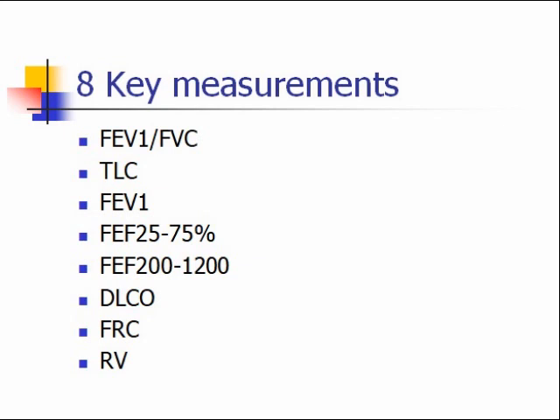Well, that does it for interpreting pulmonary function reports. I hope this has been helpful. Pulmonary functions are a lot of data. They scare a lot of people, but if you focus on the 8 key measurements, then you will be able to do very well at identifying what the patient's condition is. Hope that was helpful to you, and I'll try to do some other educational pulmonary respiratory presentations. Thank you very much.